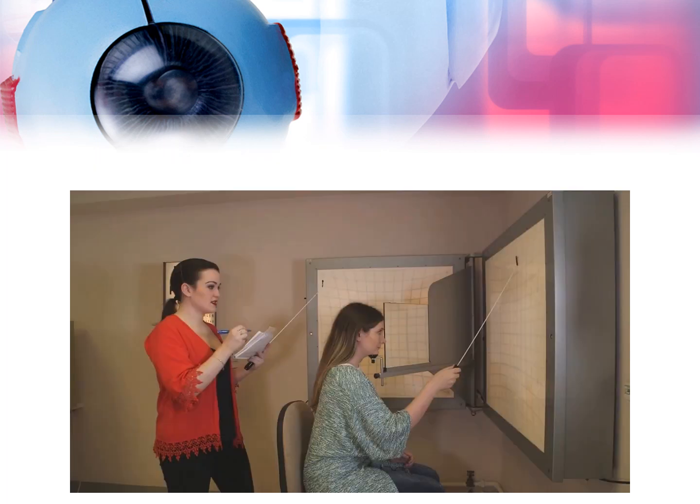The examiner points on a point on the illuminated screen. The patient is asked to point with his pointer at the same point on the non-illuminated screen. The examiner illuminates the non-illuminated screen temporarily to see and plot the patient's response.